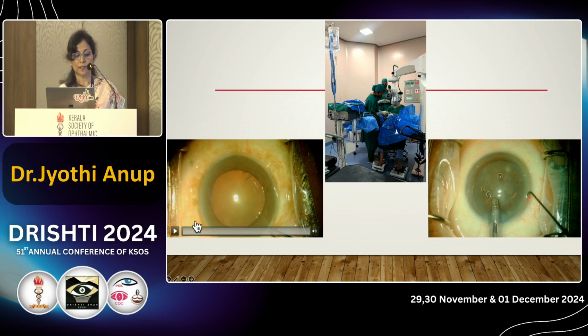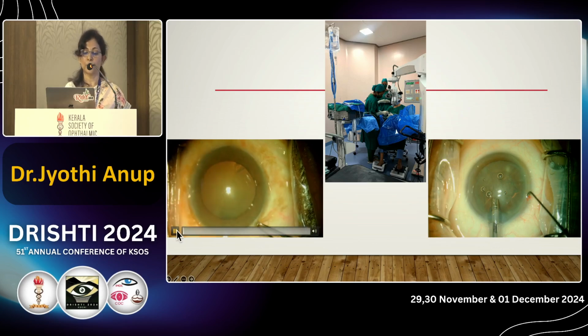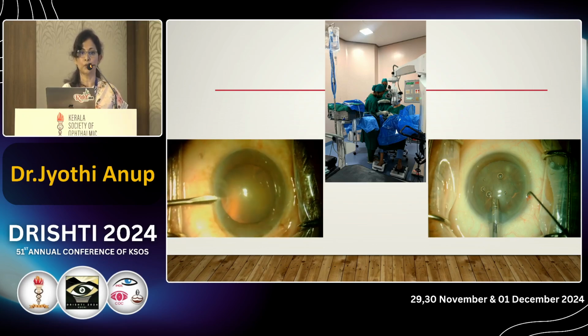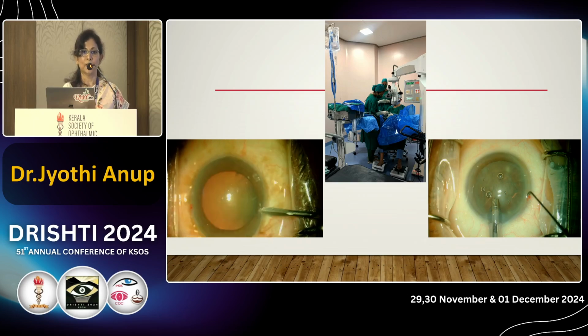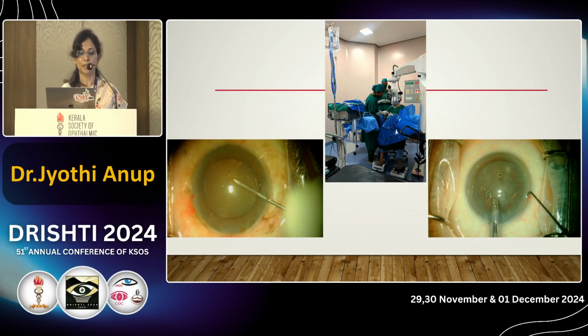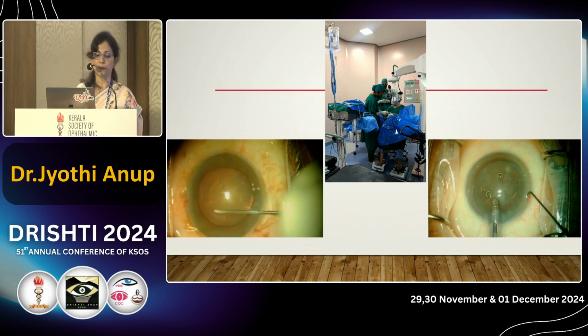And before starting scrubbing, you should go into the OT, and adjust your chair, microscope and foot pedals. I am telling you, sitting on a chair with wheels, with all 4 of your limbs engaged, and doing a tough surgery is no fun. You have to have some time to do it.